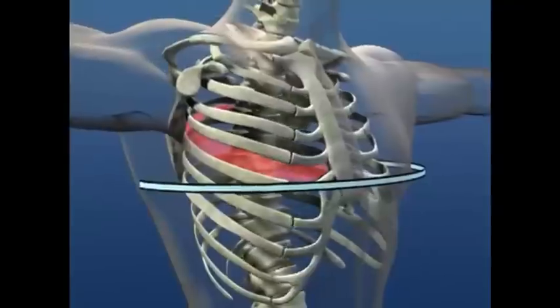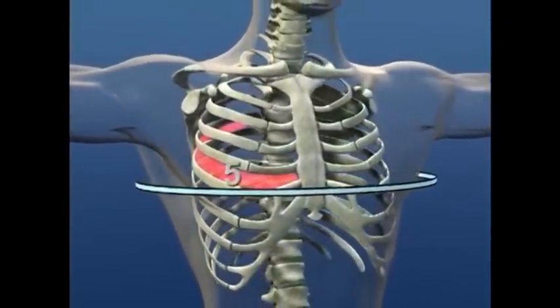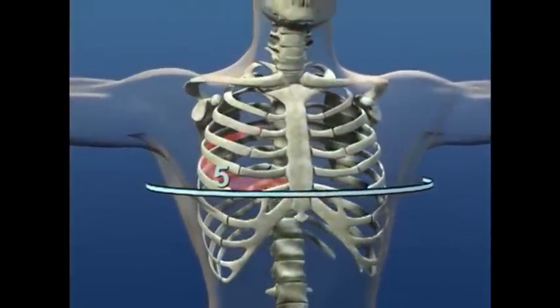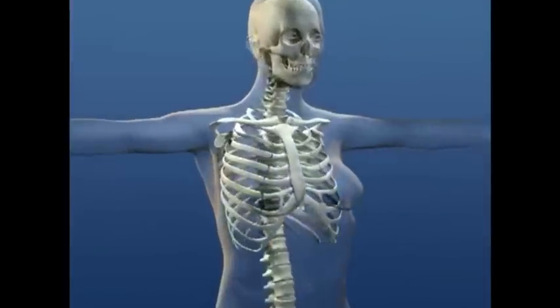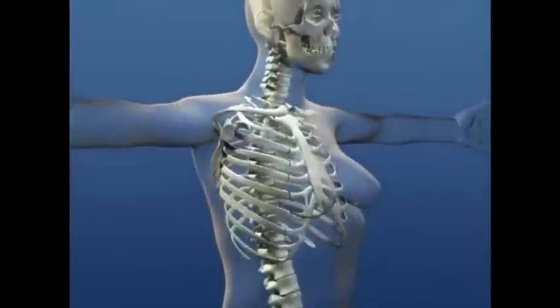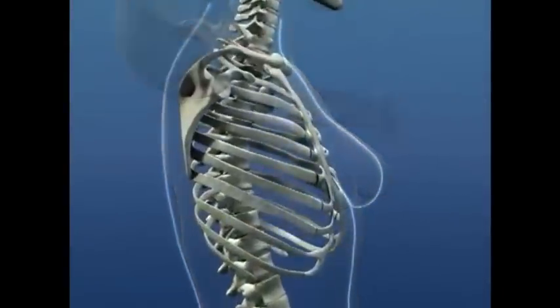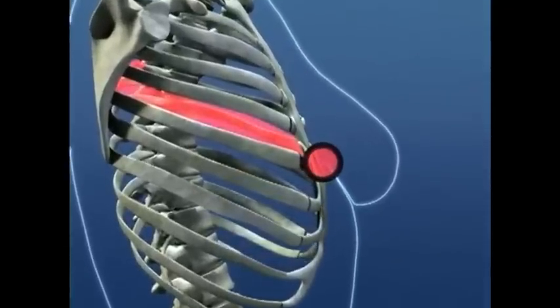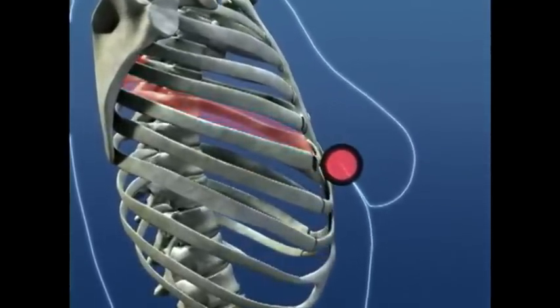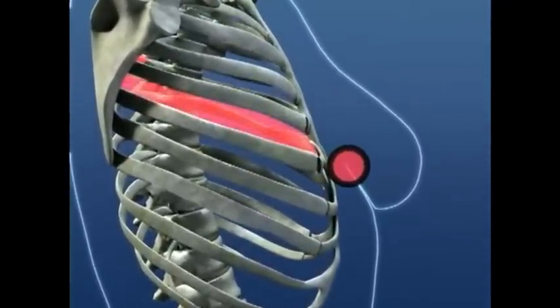This can be found by using the nipple level as a landmark for the fifth intercostal space. In females, always be aware that the nipple may be displaced inferiorly due to large pendulous breasts. In this case, remember to stay above the inferior mammary fold where the nipple would normally lie.